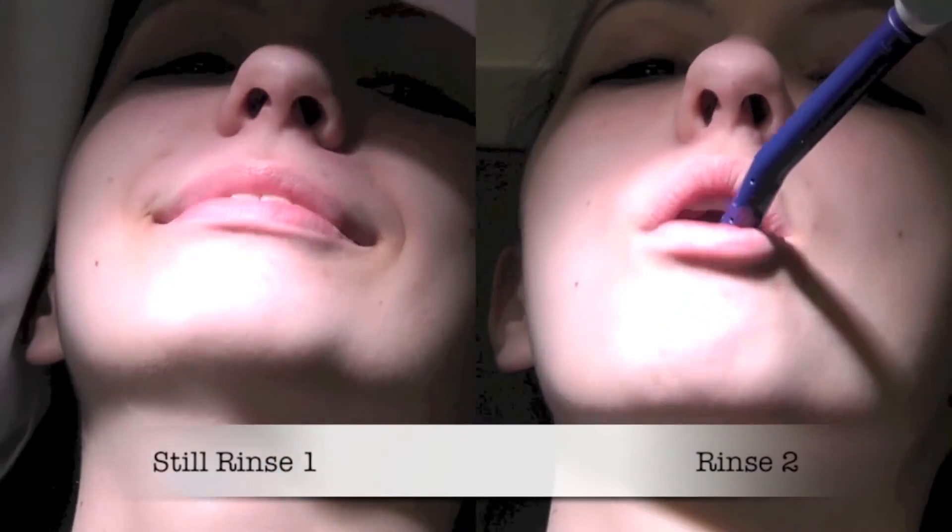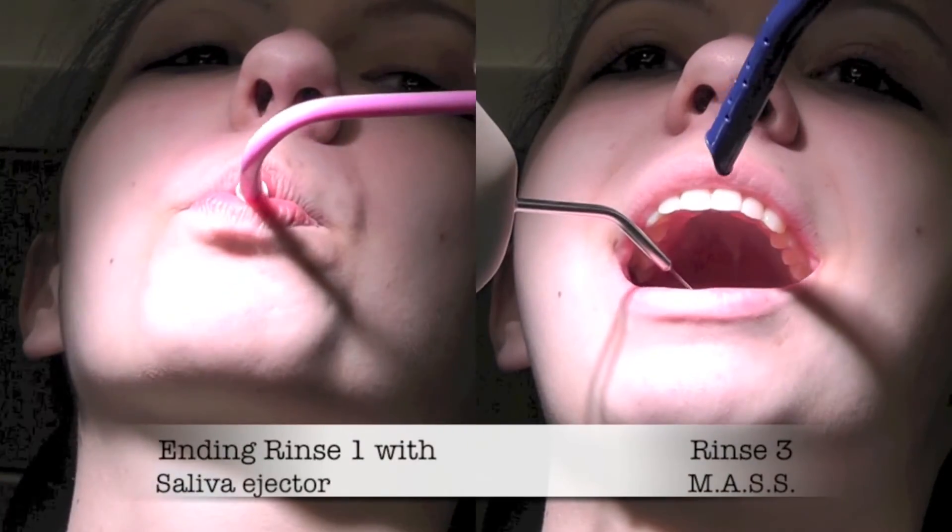One of the best compliments from my patients came during demos — they were actually upset during the trial phase. I was trying it out on them, and when we took it away because I ran out, the only color we had was blue and they're like, 'Doc, where's that blue tip? This other one — I'm getting slobber all over.' I kind of spoiled them a little bit.